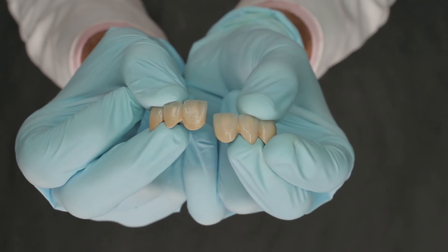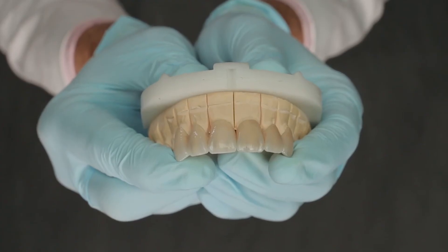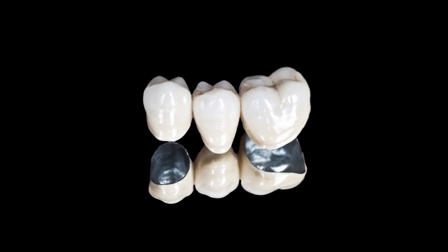I also have two anterior Delight bridges, and you can see the kind of detailing which is possible with these. In the anterior zone, we can make both crowns as well as bridges using Delight.